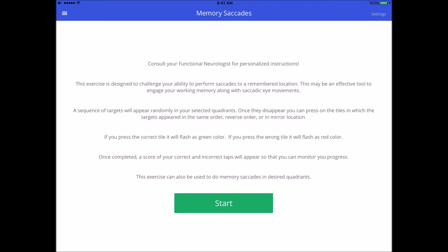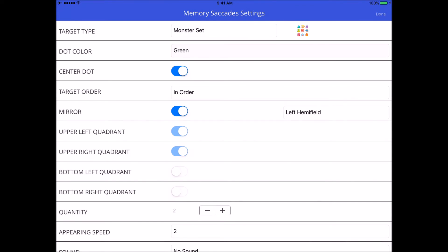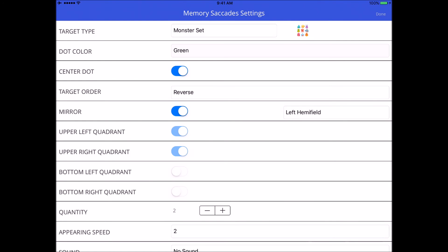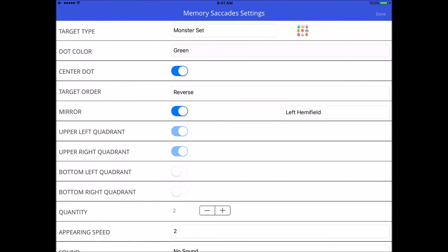If I want to do mirror with hemifield in reverse order, we can try to make it harder — left hemifield, reverse order. First target appears, look at it, back to center, second target, back to center. Now I find them on the hemifield they appeared in but in reverse order, and then do the same in the opposite hemifield in reverse order. That's how this one goes.